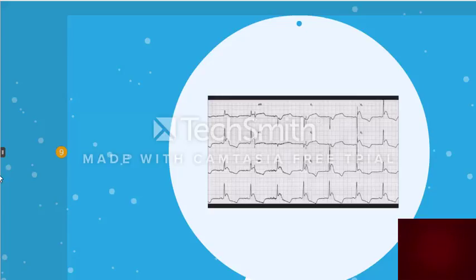So this is one of those ECGs that the LIFEPAK is going to say, hey, meets STEMI criteria, that kind of thing, because that's all it's able to really look at. But if you look at it closely, you can see the morphology here, and you can understand that this is not a STEMI at all, right? It's got some of the ugly morphology that we talked about in the BER video, but this is actually a bradycardic rhythm from someone who is hypothermic, and they do not appear to be doing a lot of shivering, so this will be in severe hypothermia, all right?